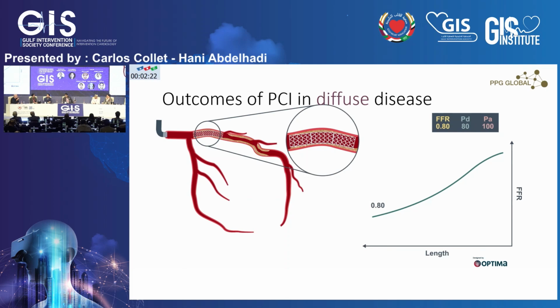I didn't actually. I didn't think angiographically I wasn't attracted. Maybe I should have, but I didn't. I interrogated the RCA, which is possibly non-dominant, but the IFR was 0.95 or something. The other question I've got, if I can, to Carlos. This guy with lengthy diffuse disease, would a LIMA help him or no?